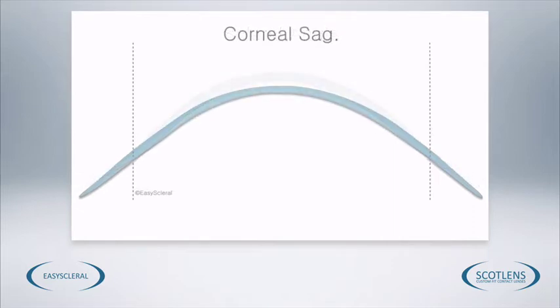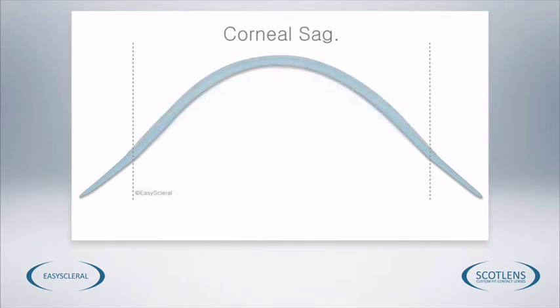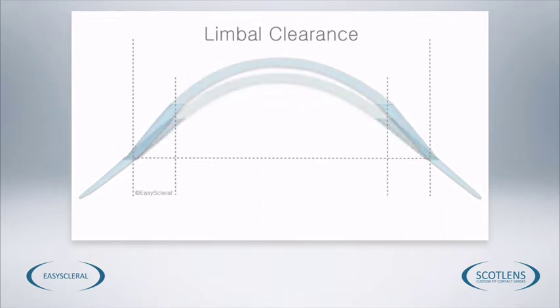The corneal sag allows us to alter the area vaulting the cornea, and this is fitted dependent on the extent of the corneal ectasia. We can also alter the limbal clearance, so the peripheral cornea. If the peripheral cornea is very steep, then we can increase the limbal clearance. If it was very flat, then we can reduce the limbal clearance. These measurements are all taken from the slit lamp, which we'll cover later on.